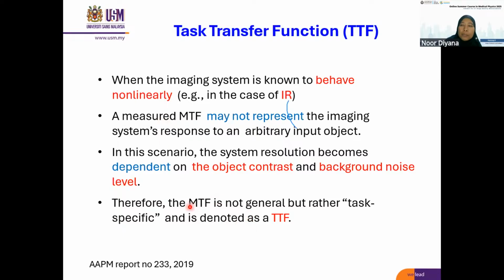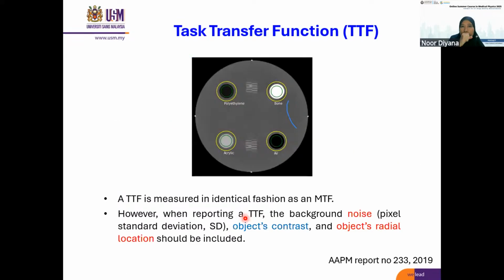So MTF will not be a good parameter to represent your spatial resolution, and you need a task-specific metric known as the task transfer function, or TTF.